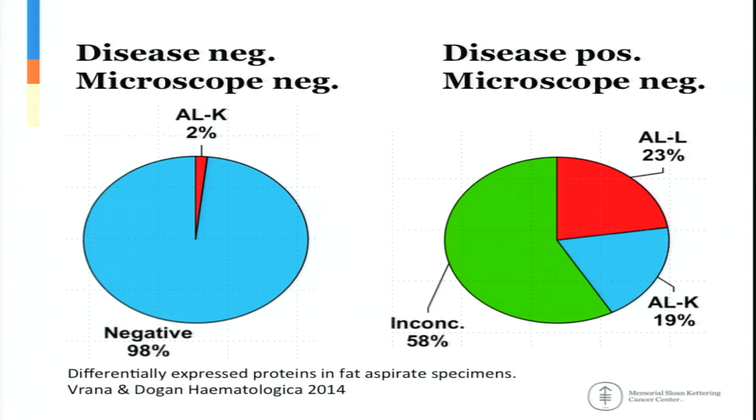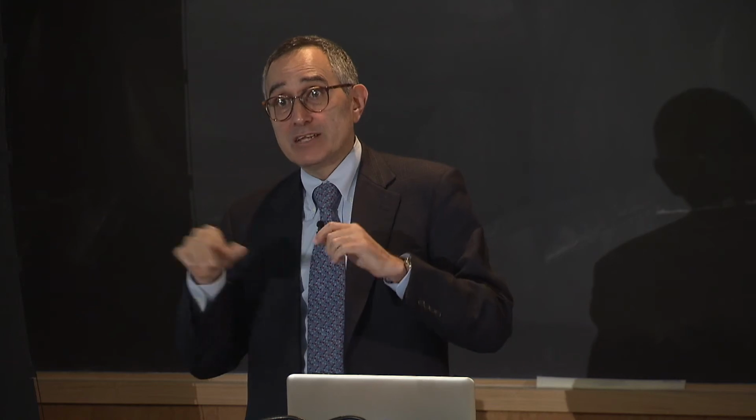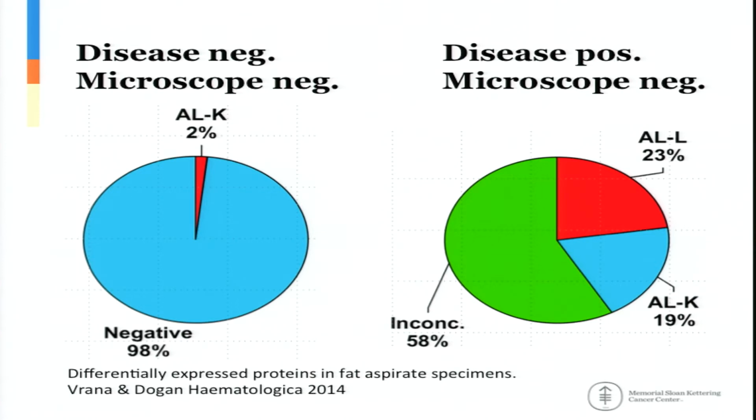But what was most interesting was that there were cases where we know the patient has systemic amyloidosis, but the fat aspirate on morphology was negative. So we couldn't see the amyloid, but the patient had documented amyloidosis elsewhere, and half of those patients had the signature of amyloidosis. So in some ways, this told us that the mass spectrometer had possibly higher sensitivity to diagnose amyloidosis. We have not translated this. This is a bigger challenge, to change Congo red as the gold standard, making it into proteomics. It is a big undertaking. We haven't done that, but we use this now as a screening tool.